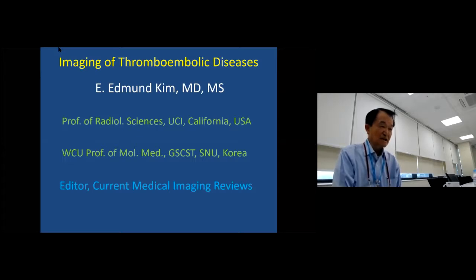So if you find any better way to diagnose and treat those conditions than what we can do now, you'll be rich and famous. And also, if you find some way to prevent these problems, then you'll be even better than what you anticipate. So I'm going to review imaging of thromboembolic disease.